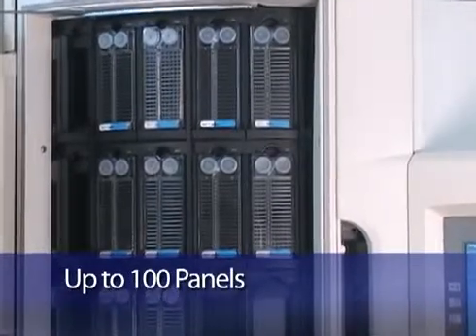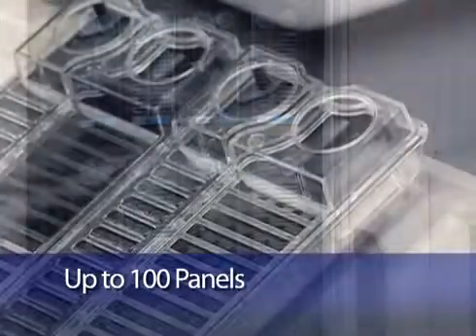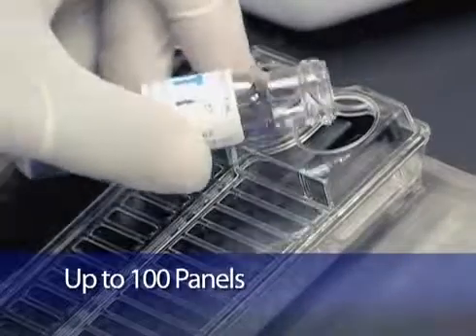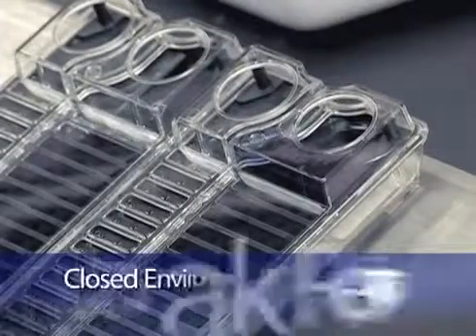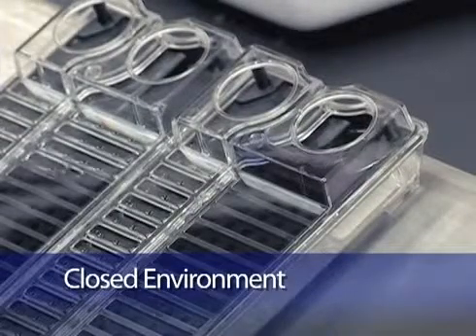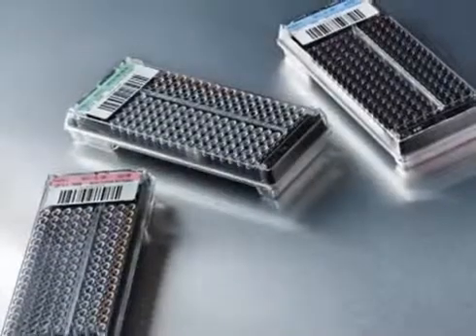Up to 100 self-inoculating disposable BD Phoenix panels at a time can be used with the BD Phoenix system. The patented BD Phoenix panel is designed for self-inoculation and is virtually leak resistant while providing a closed environment which maintains humidity levels.